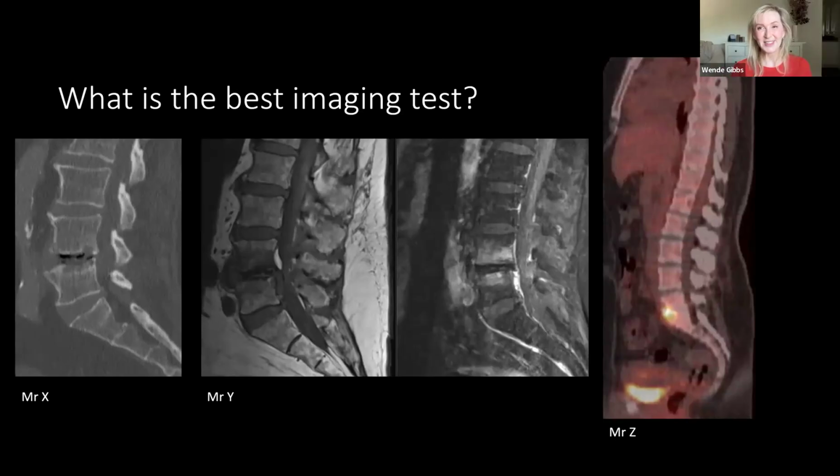In the nuclear medicine literature, they say that PET, which you see on the monitor over there, can also help, although that is much harder to get, more expensive, and there's radiation. Maybe it doesn't matter that much, but if your MRI isn't helpful or you can't get it, you can try PET. And this is a very unpopular opinion amongst radiologists, even people in my own group, but I like CT a lot. I think these days our CTs are just as good, sometimes as good as MRI.